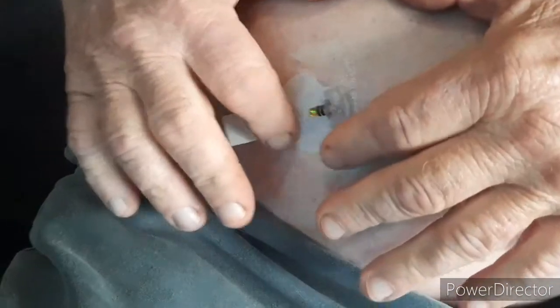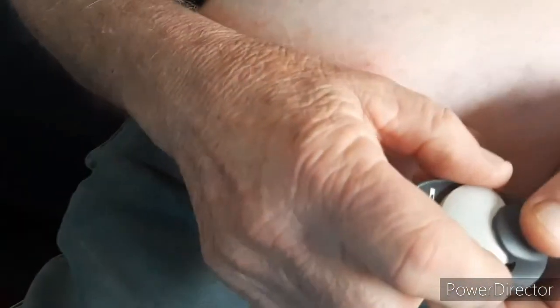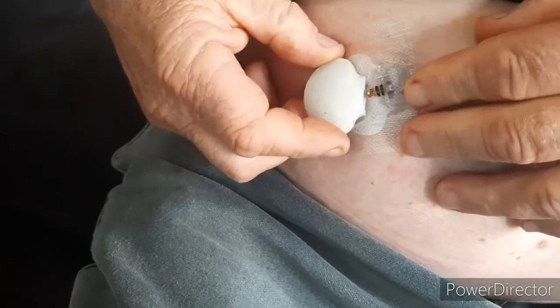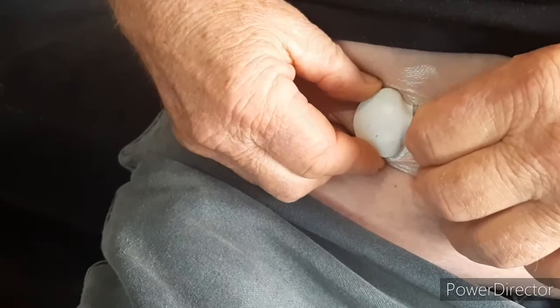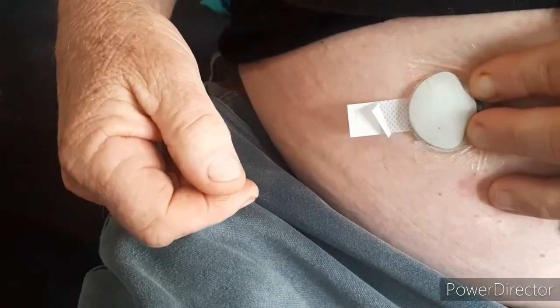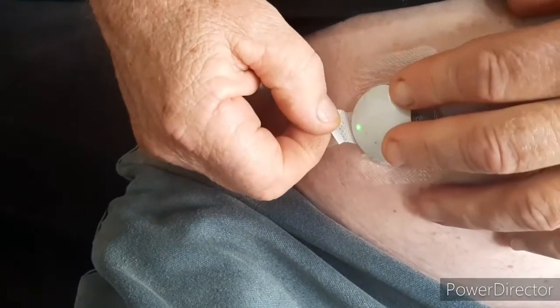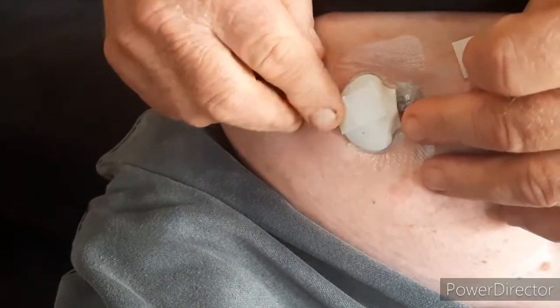Grab the sensor out of its charging bay and lock it into position. Wait for the green light to come up — you see that green light? Once that's happened, place the adhesive strip over the top, covering that green light.